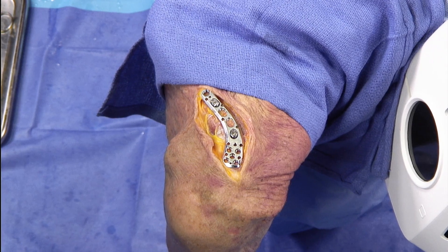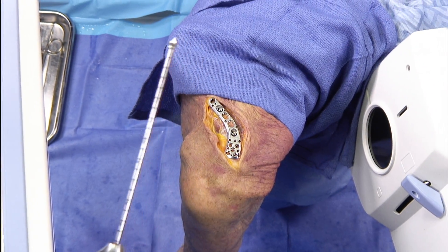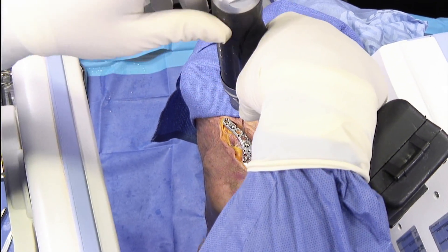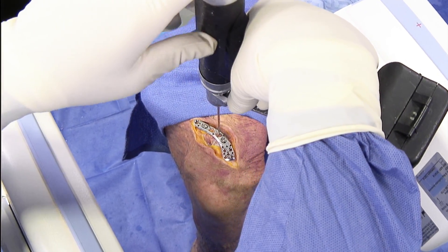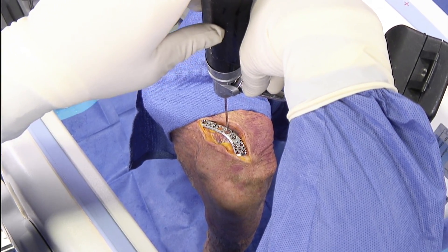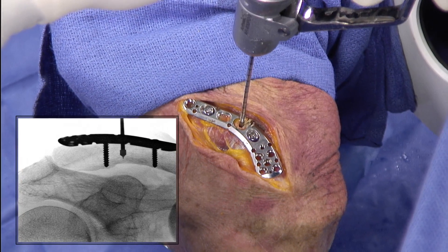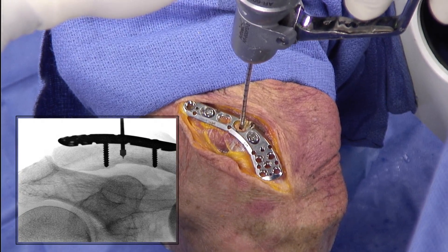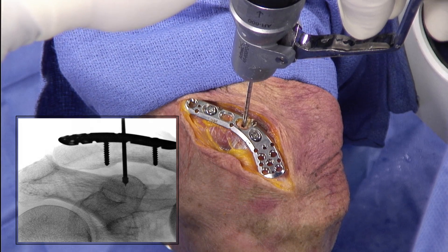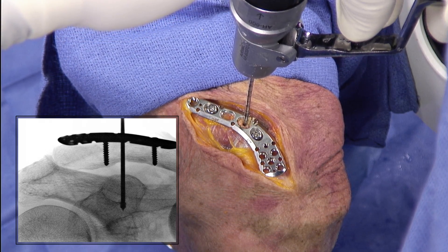This procedure is based on the fact that at heart we're all trauma surgeons, and we've all drilled bicortically into tenuous areas. With care we can avoid injuring the neurovascular structures. So what we're going to do is drill bicortically through the clavicle, then palpate the coracoid below and drill bicortically through that as well — coming through one cortex and then the second cortex, which you can see nicely here.